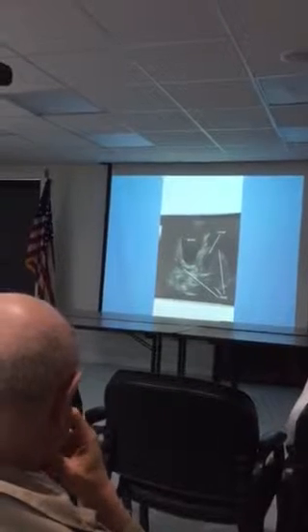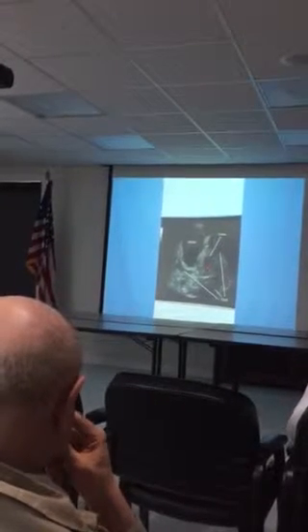There's another one. This is for the female. This is the bladder here. This is the uterus here. And this is the fluid.